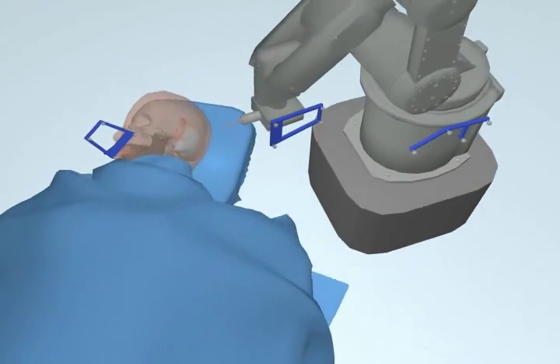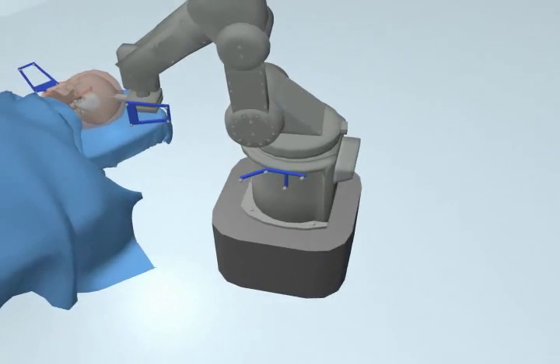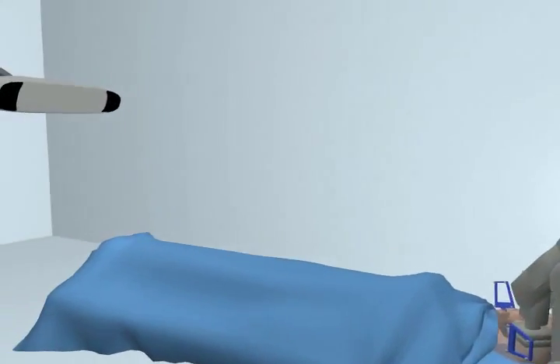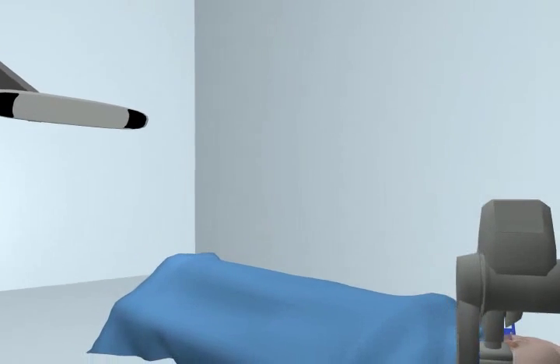For this purpose, frames with trackable spheres are attached to the parts of the robot and to the patient. In our case, the frame is attached to the teeth of the patient.